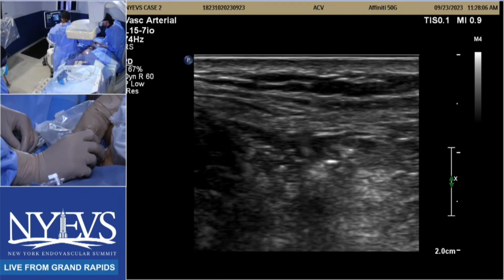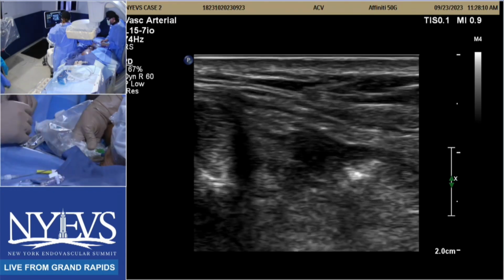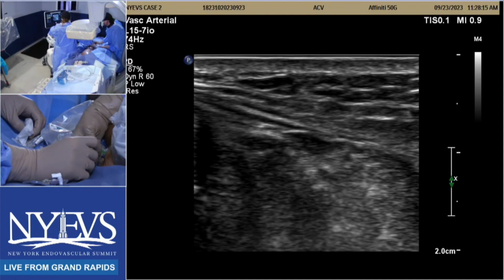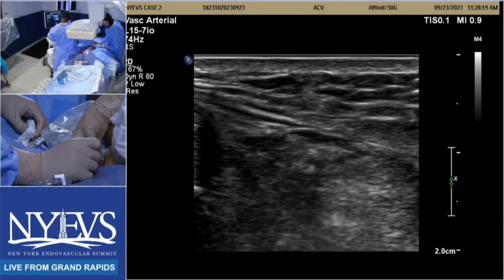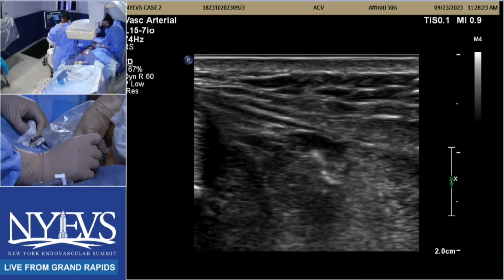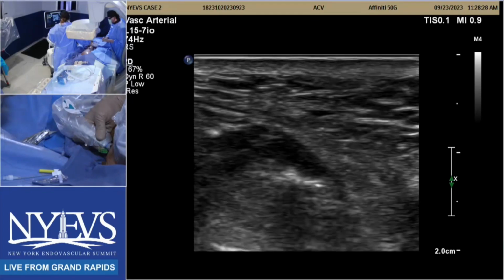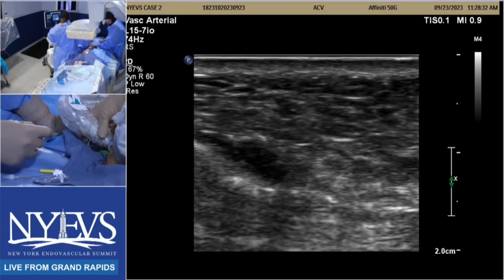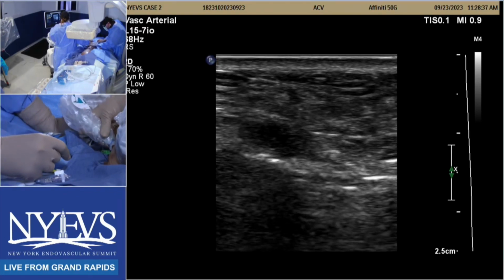Well, a couple of thoughts. One, the tissue loss seems to be minor. Two, the aortoiliac segment is okay. The fem-pop segment is treated, which is not a long-term option in terms of reinterventions in the future and recurrent tissue loss, which is the norm, particularly in this setting. The anterior tibial is compromised, so you don't really know if they are hibernating or not. So I would say maximize what you have, but you are not burning the bridges by attempting a recanalization of a PT.